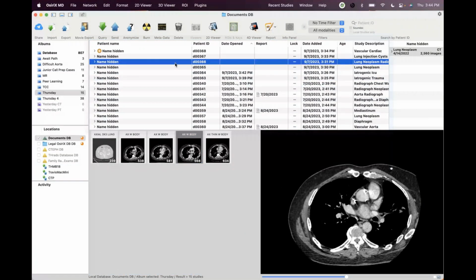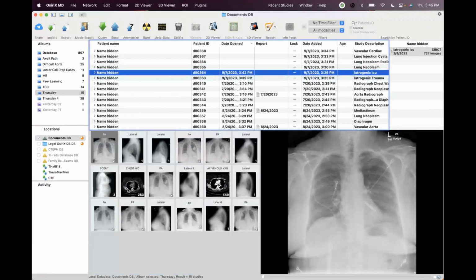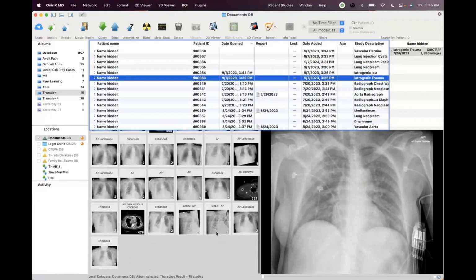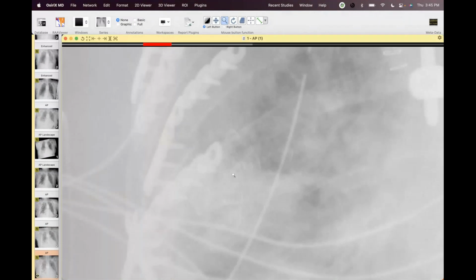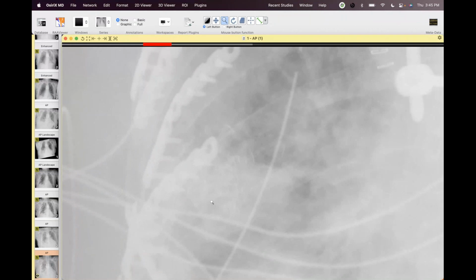All right, I wonder if the stuff actually, when it soaks up fluid, becomes hard to see. Maybe it looks just like gelatin or something like that. It may disappear. Maybe that's why they get left behind. No, it's not like Gelfoam. It's not something that dissolves, but I think that little radiopaque portion is so lucent, or it's just not very dense at all. I think it's just not designed well to be seen. Clearly a radiologist was not consulted in the development of this product. Even a dedicated chest radiologist? Yeah, right.